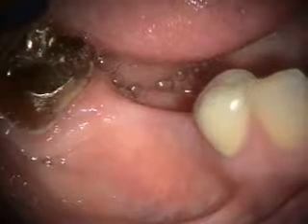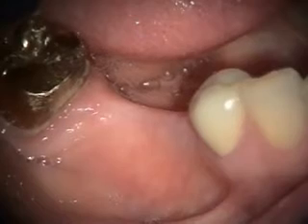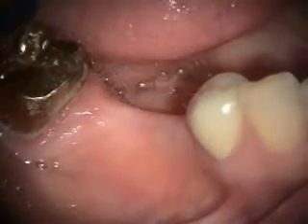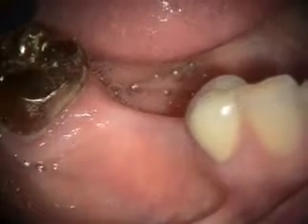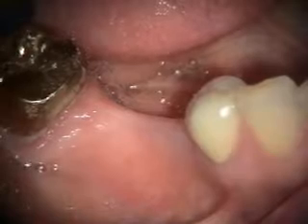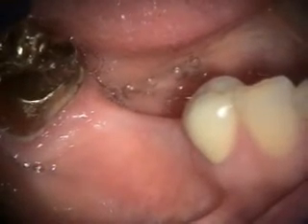This is about the two and a half month healing of the extraction and bone graft in the number 29 site. You can see that she has a thin band of keratinized tissue, and so the ridge is thin on the coronal edge, but once you get down about four or five millimeters it starts getting really wide there. So she just has plenty of bone for an implant and that's what's next.